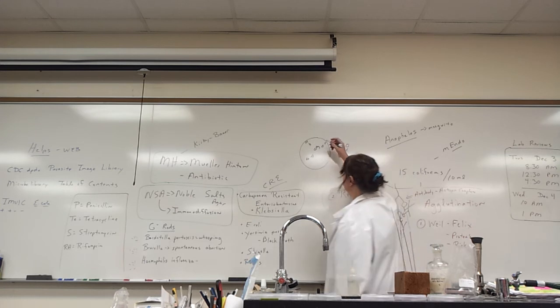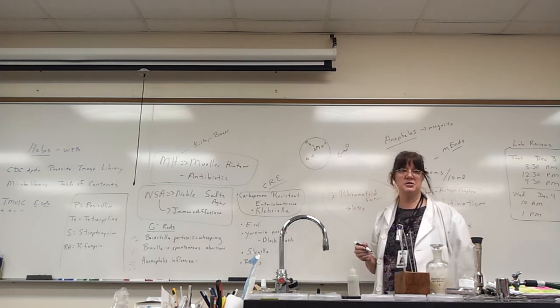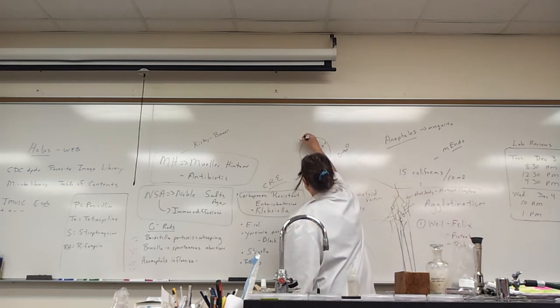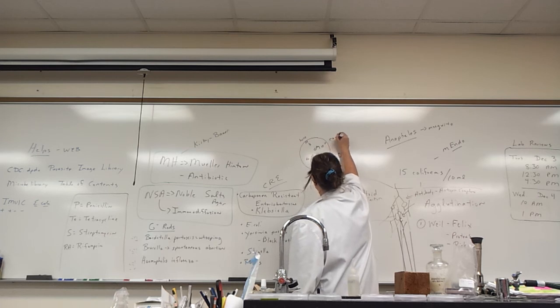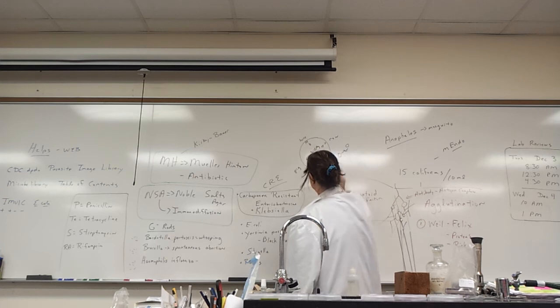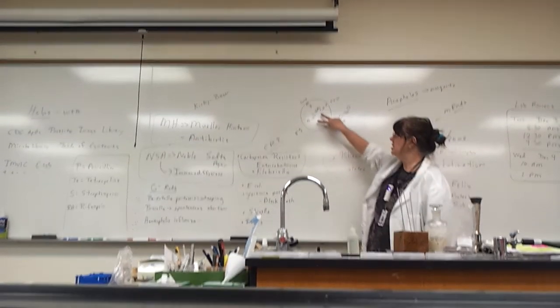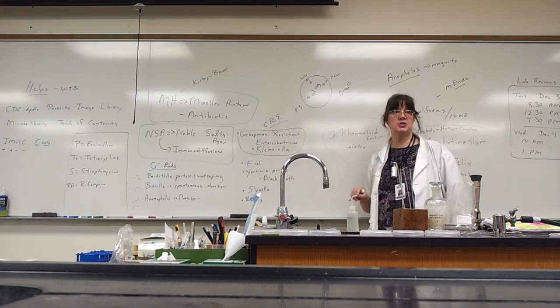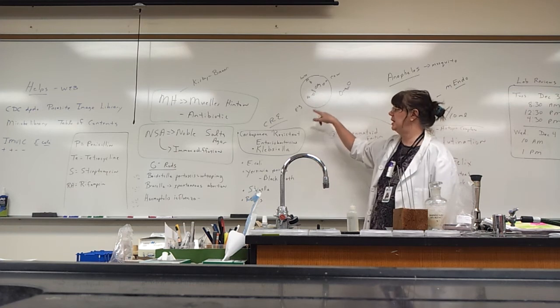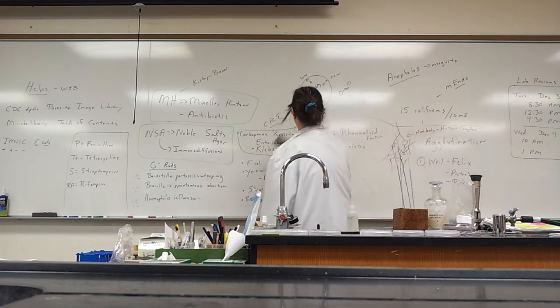Now here's where I'm going to go. If you want to know what was in the center, you didn't know because it was A, B, or C. And you know that this was horse, cow, and pig. It's actually bovine and swine. Your small, pale white line is your antibody antigen complex formed between these two. What was your center antigen? It was pig. Now, that's for practice.